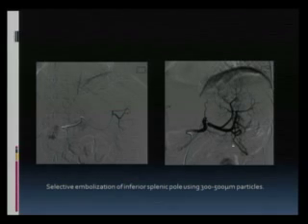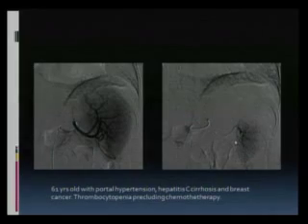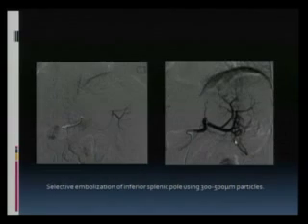This is during the phase, selective embolization of the inferior pole using 300 to 500 micron particles. This is where you are embolizing these branches, and this is the post. So if you want to see the parenchymal phase, this is the post. So you've only embolized the lower part. You embolize about 30 to 40% of the spleen.